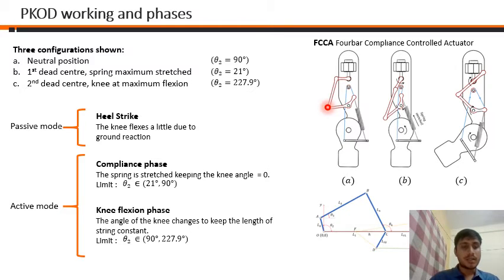The second dead center shows the maximum knee bending position. This is the maximum amount the knee can bend, and it is fixed by the dimensions of the mechanism. At the heel strike, where the heel makes the first contact with the ground, the knee bends a little, which is supported by the spring. This mode, where the motor is not rotating and the knee is supported only by the spring, is known as the passive mode. The other two are the active modes, where the spring is stretched and the knee is bent using the wire to achieve the desired gait cycle.